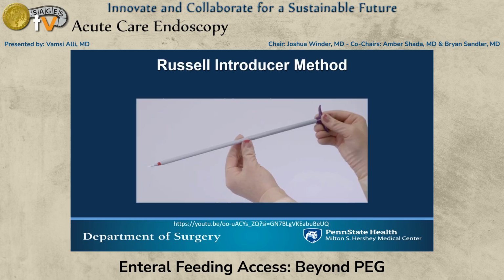So the introducer method involves a peel-away sheath and dilator system. This can be a one-piece system that's purchased commercially, or this could also be done using vascular access sheaths if need be.